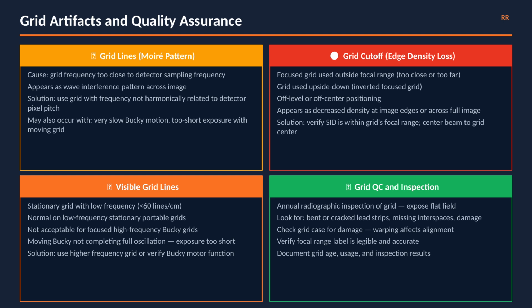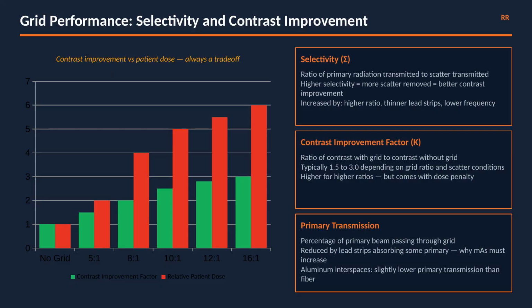Grid QC and annual inspection: radiograph the grid with a flat field. Grid performance metrics with clinical relevance.